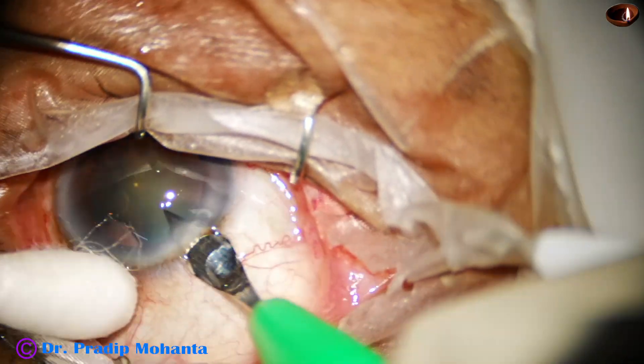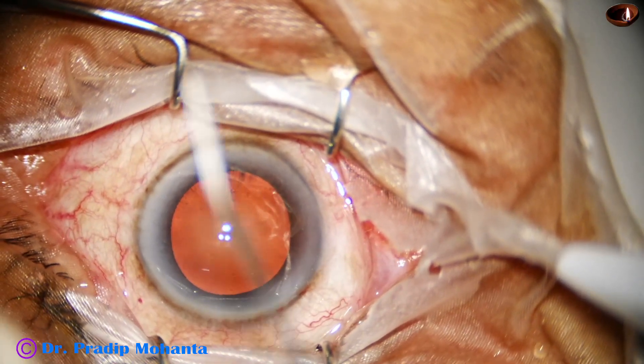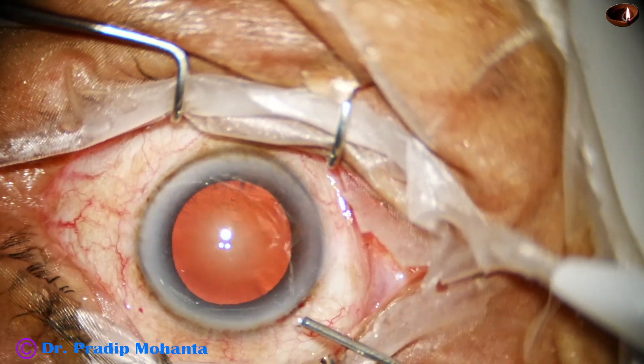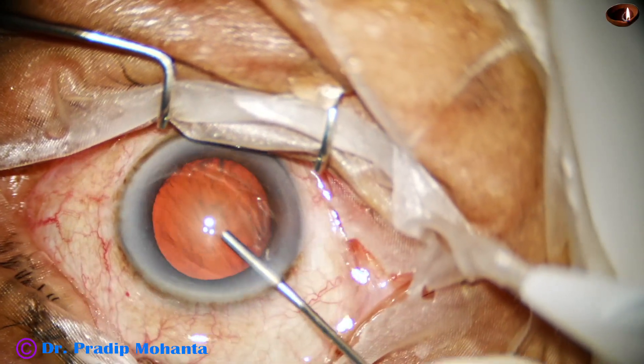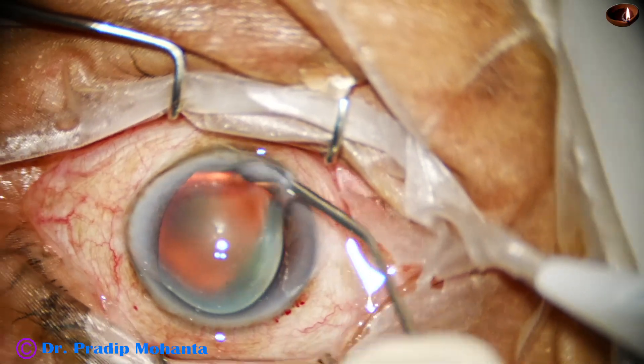This is the main incision with a 2.8 mm steel keratome on the posterior aspect of the limbus. The anterior chamber is then filled up with viscoelastic substance.